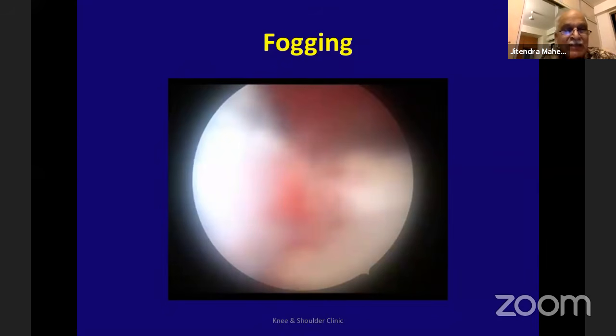But that's a mental preparation: you will not see it the way you normally do. For a lateral meniscus with a bucket handle tear that I know of on pre-op MRI, I go slightly high, because otherwise I can't even enter sometimes. That's all mental preparation based on your MRI assessment. If you know there's a locked meniscus, you know it will be a little difficult to enter, so it becomes easy because you know it is going to be difficult. It's a learning curve as you do more. Trouble only happens when you don't know the trouble, so it's best to orient yourself beforehand about the problem you're likely to face in this case.